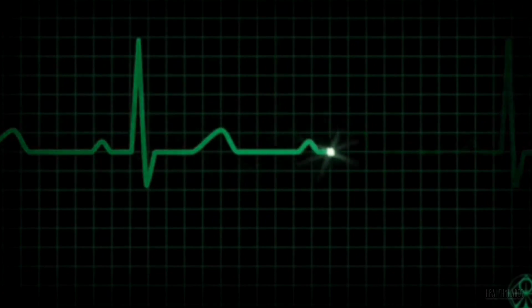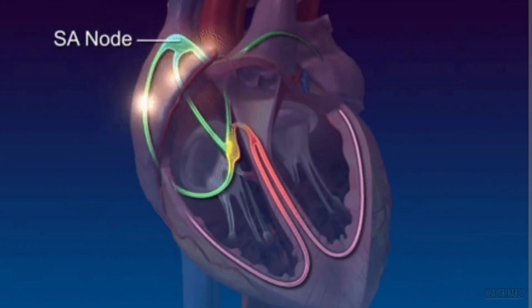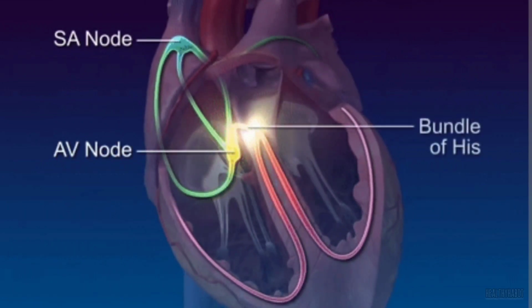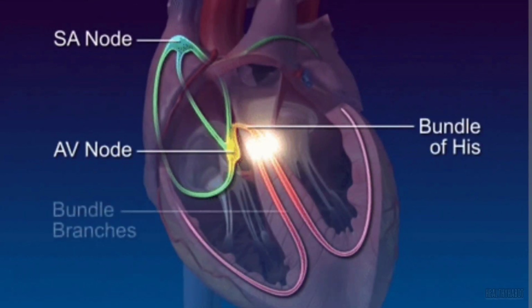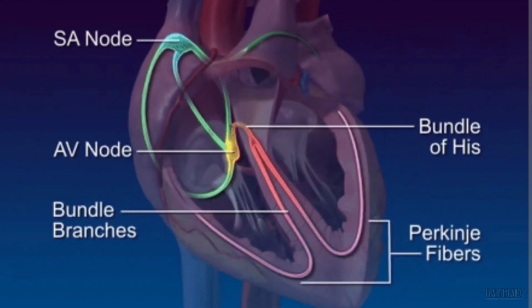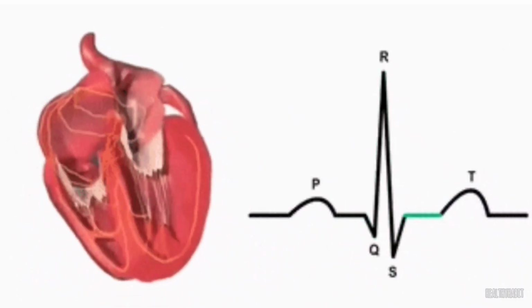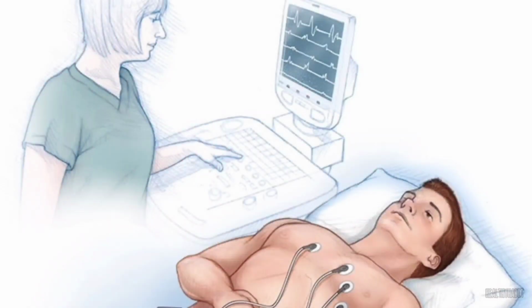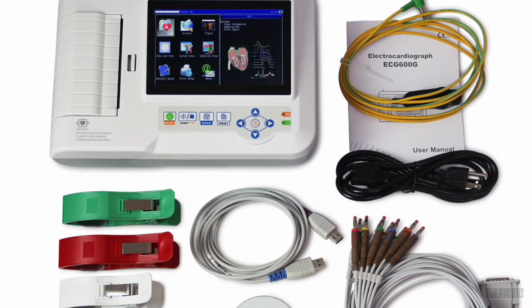The cardiac conduction system is designed for electrical impulse creation and propagation. It allows for initiation of impulses in the atrium, slowed conduction in the atrioventricular (AV) node, and rapid propagation through the His-Purkinje system to allow synchronous contraction in the ventricles. An electrocardiogram, or ECG, is a simple and useful test which records the rhythm, rate and electrical activity of your heart.